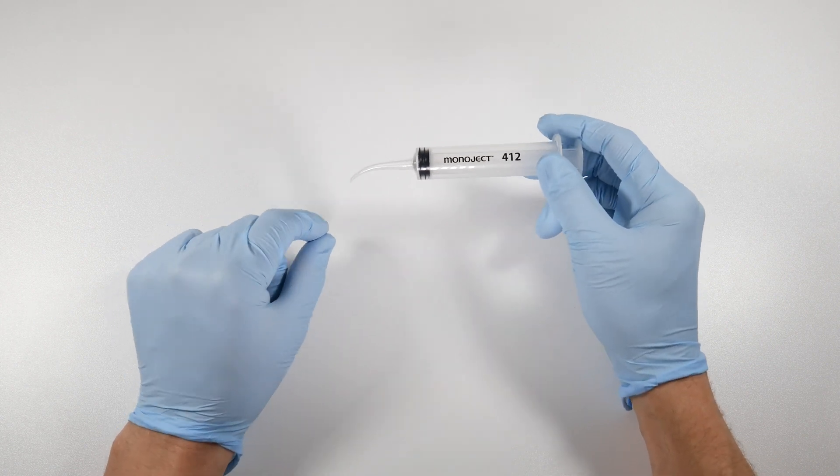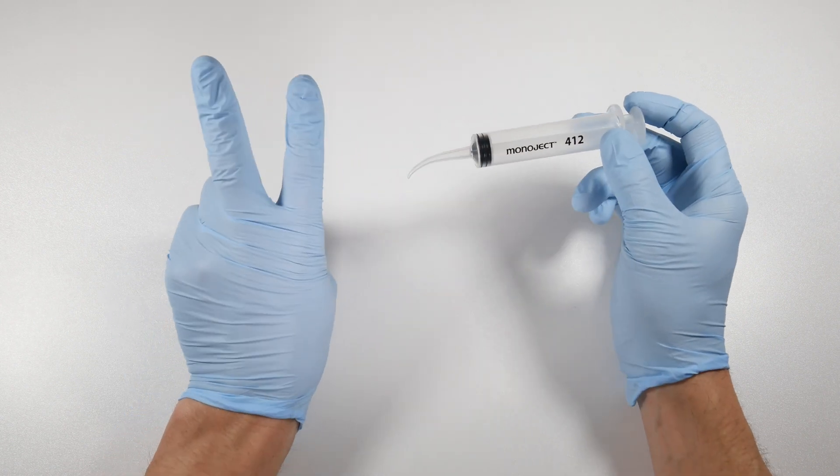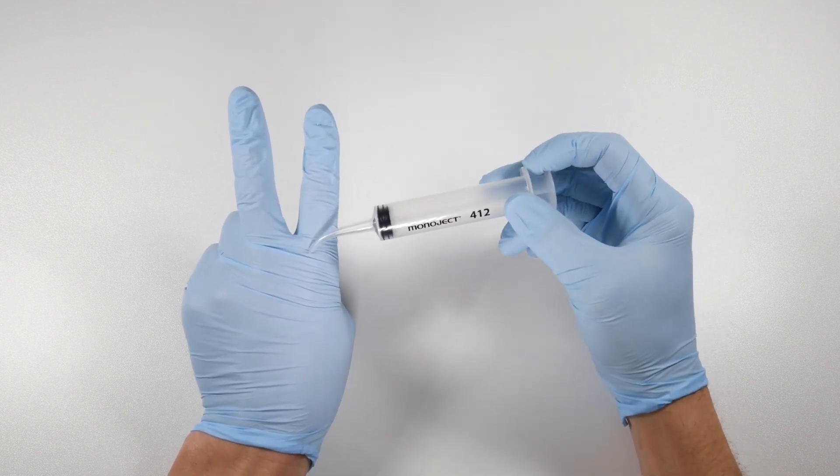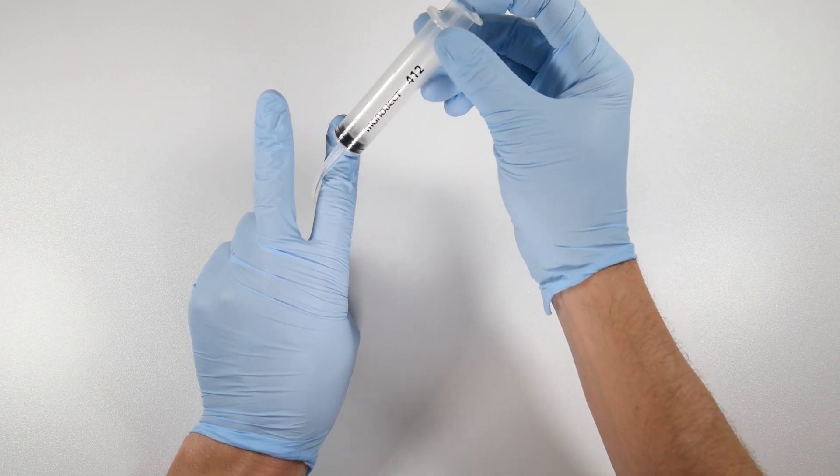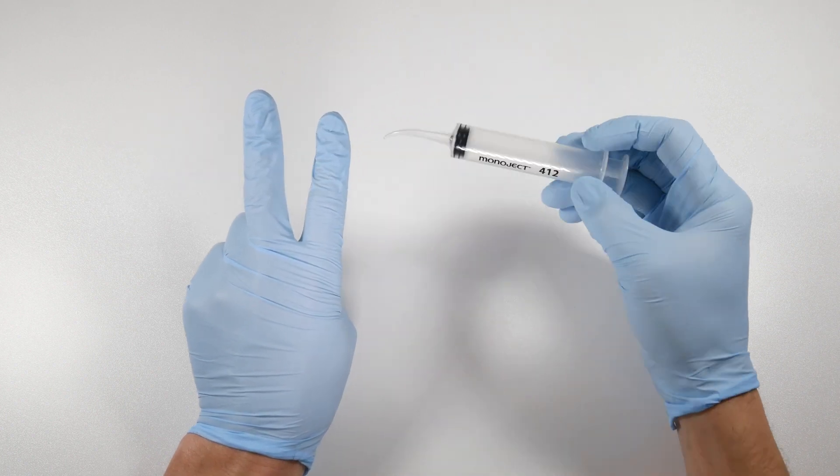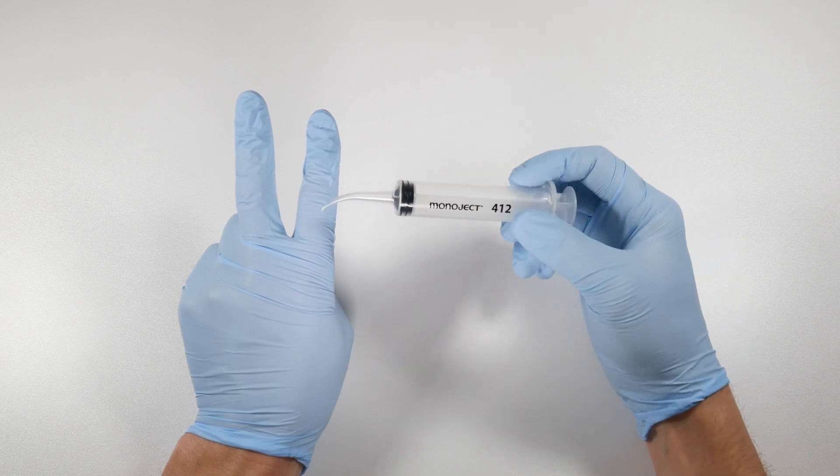The small tip allows you to get down to the base of a socket if you think how a socket is shaped. The root is getting narrower as it goes to the base, so this will allow you to reach way down as far as you can into there to make sure you get all the debris out from the site.